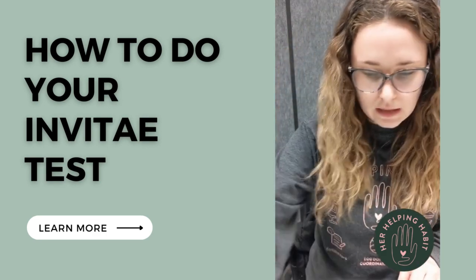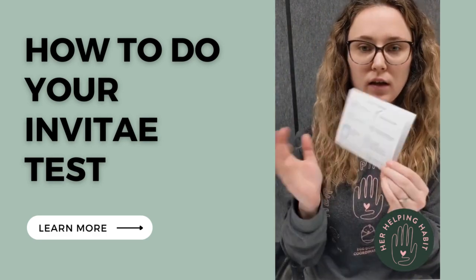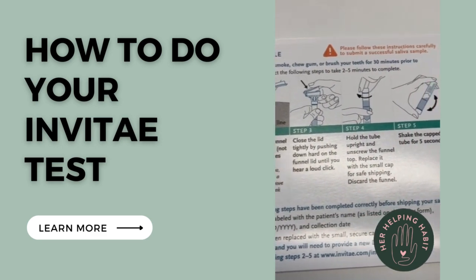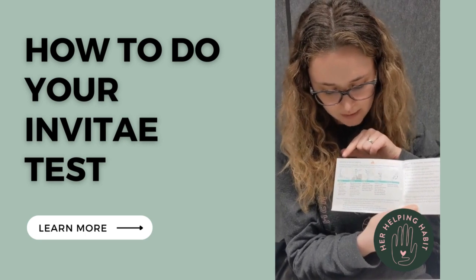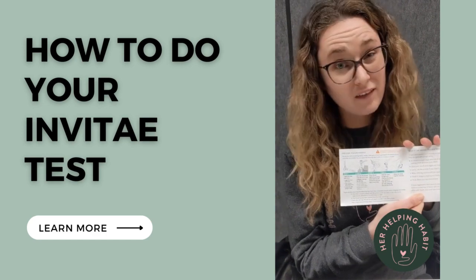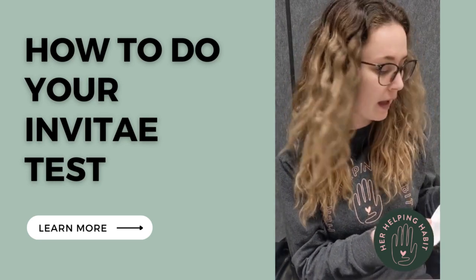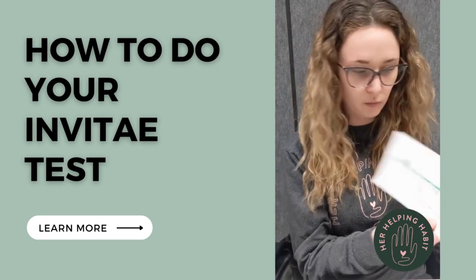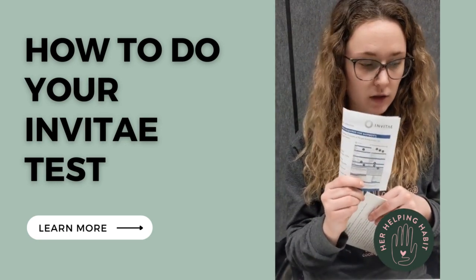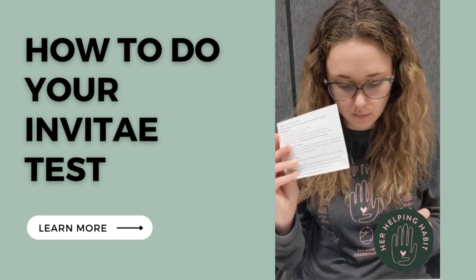Inside the instructions, to provide your saliva sample there are steps one through five — they're pretty straightforward. If you read this and have any questions, reach out to myself, Sarah, or whoever your donor coordinator might be and we'll help you. Everything you need is in here. This instruction kit is for shipping instructions, so I'll set it aside with my FedEx pile and get on to the saliva test.